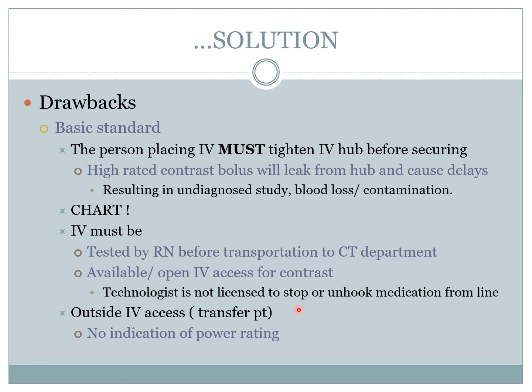They're not allowed to unhook the medication because we don't know what the medication is for, and that could be harmful to the patient. So it's best if the IV is tightened, tested before they come, and also available with nothing connected to it.